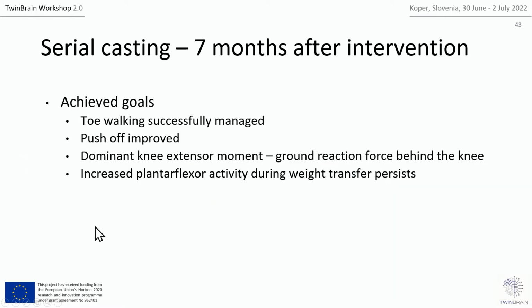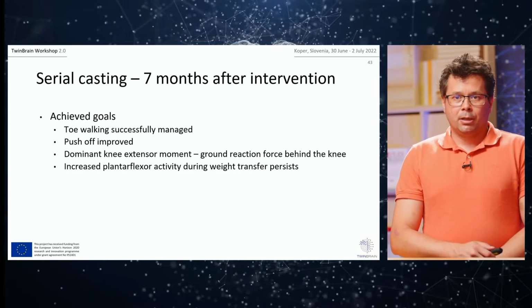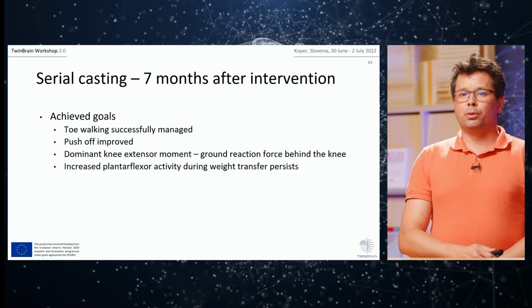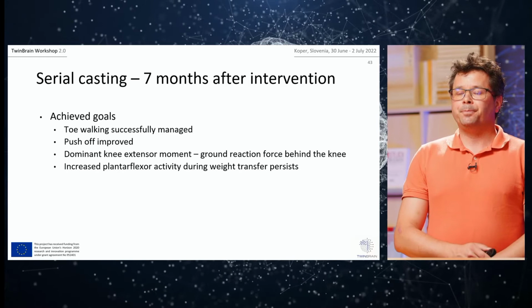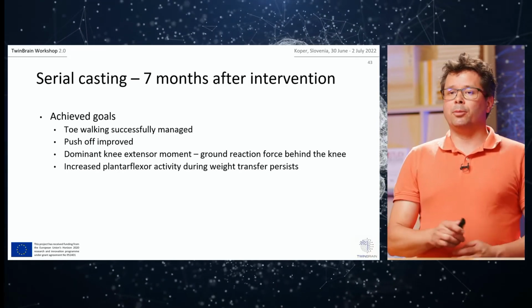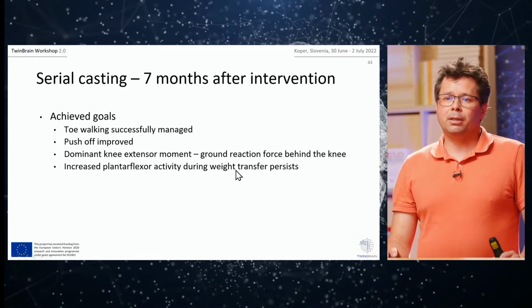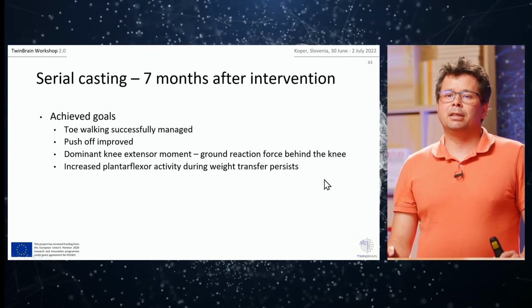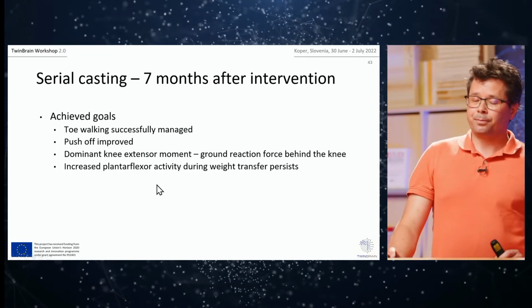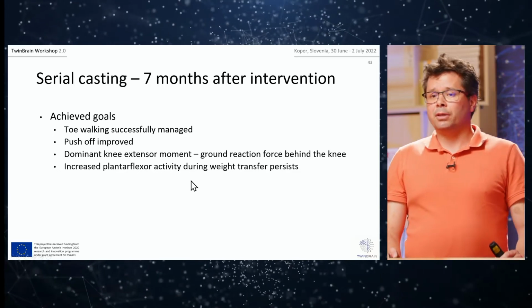So what did we achieve by applying serial casting in this particular child? First, the toe walking was successfully managed, the push-off did improve, and now after the intervention, the knee extensor moment is dominant as opposed to the flexor moment that was dominant before the intervention. But there is some increased plantar flexor activity present during the loading response, still present even after the intervention.